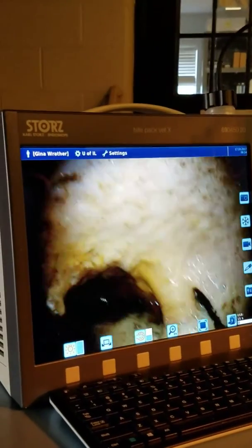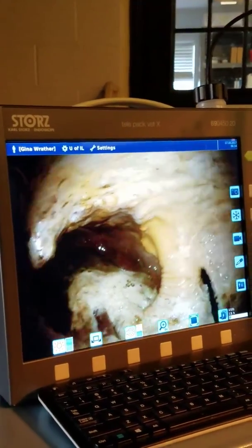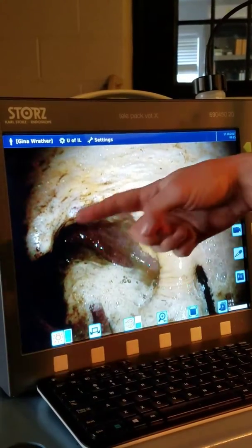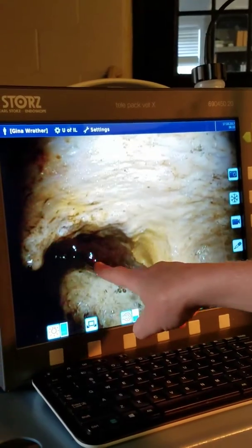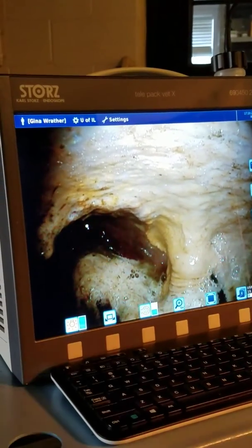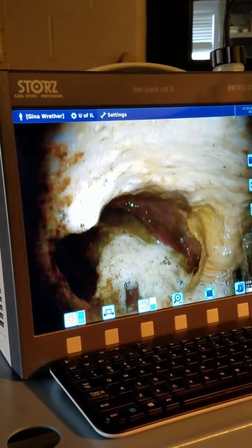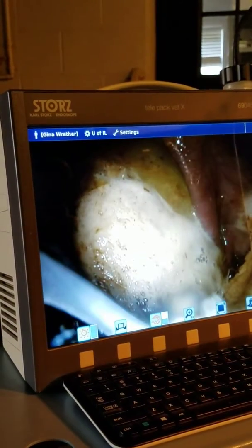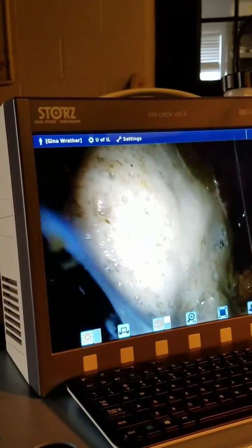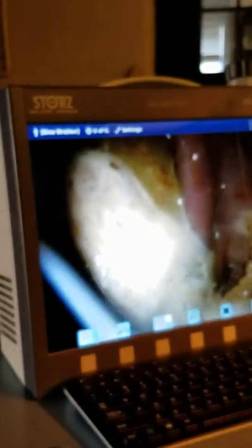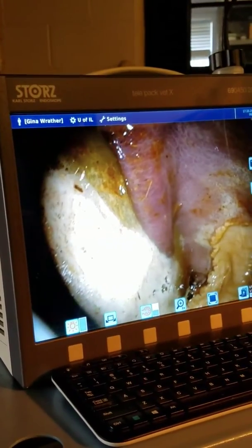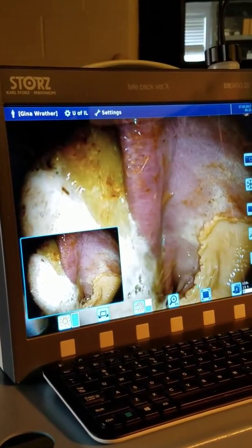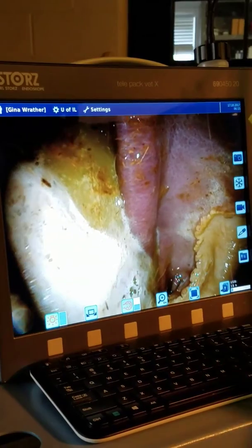Most of the non-glandular ulcers form here — this is where we're coming into the stomach, going into his esophagus up there. We're wrapped all the way around that part, and that's where all the acid is produced. I'm going to try to blow this part of his stomach up and then see if we can sneak under that part and take a look down there. There are a couple little spots here.